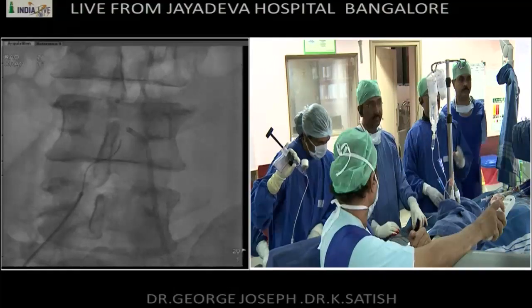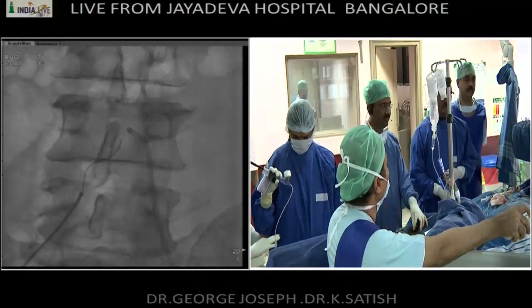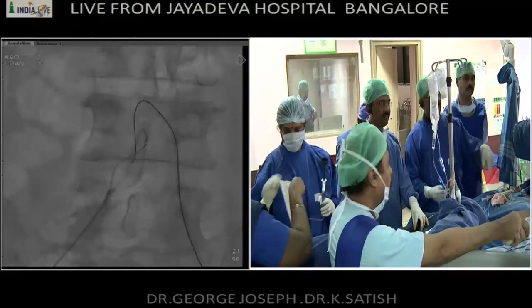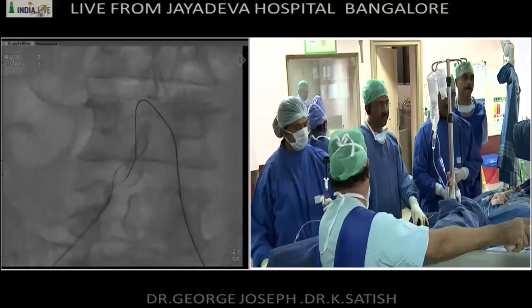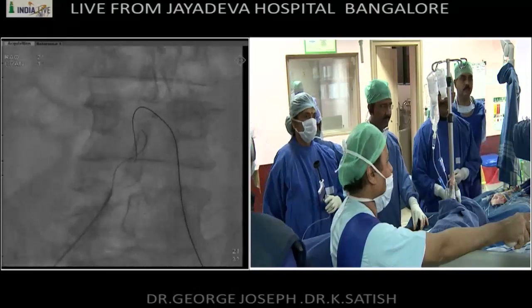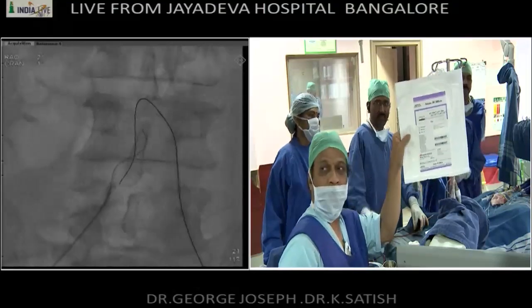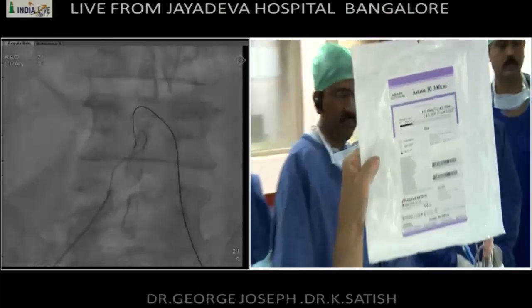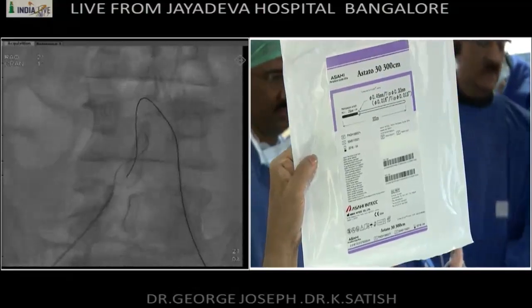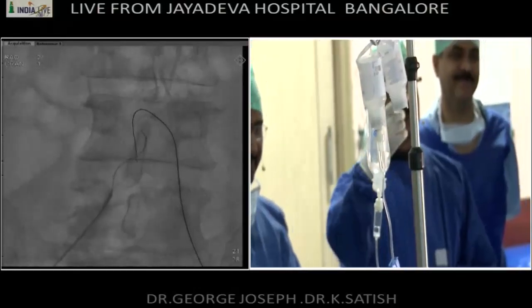The retrograde wire was not falling into the true lumen in the terminal aorta. So next slide. We decided to go antegrade from the contralateral approach. And the wire that I am very fond of to do this is an Asahi wire called the Astato. Can we show the cover of that? It's a penetrating wire. It's 30 grams, so it penetrates practically anything. And so we were able to manipulate that.